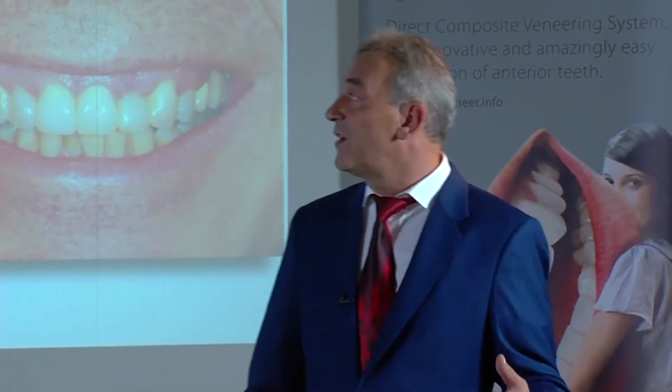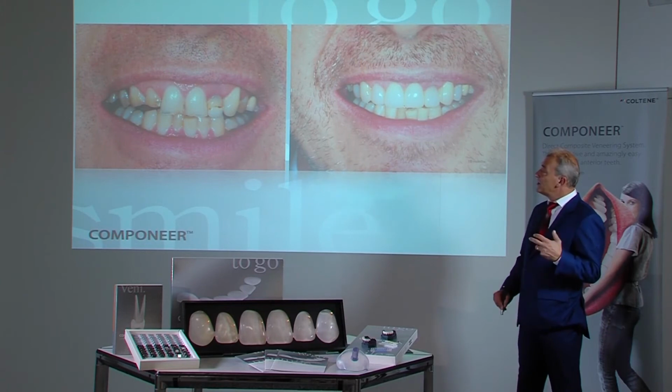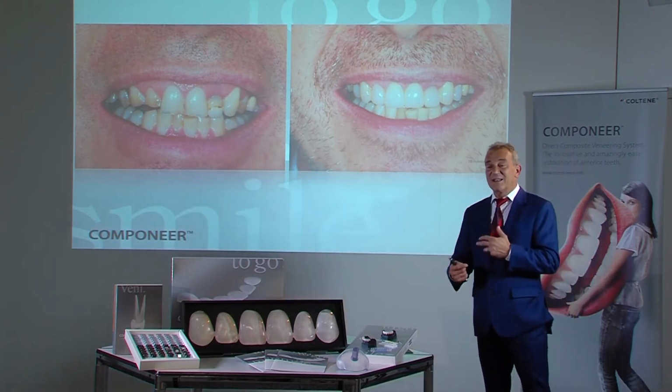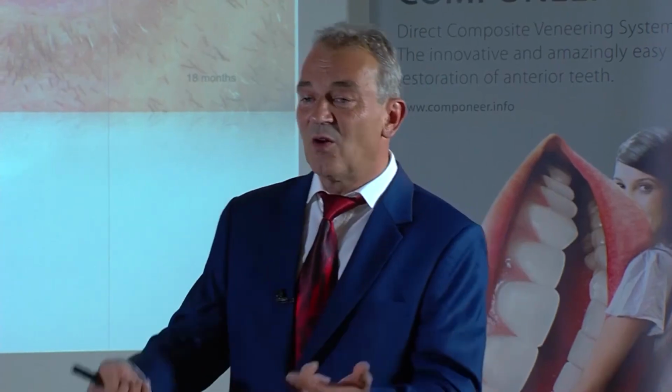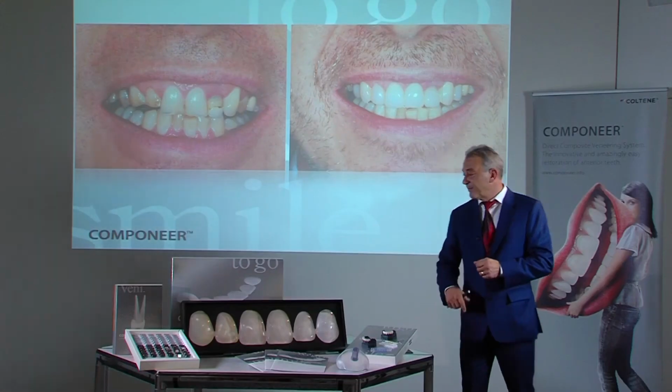This involves a number of factors. We have root-treated teeth, we have extensive restorations, and we have gaps requiring restoration. This can also be achieved with composite in combination with componeer, which provides the shape and color shade.